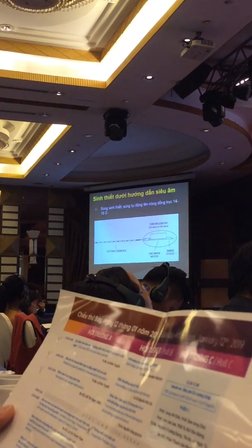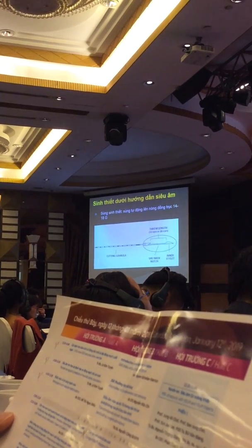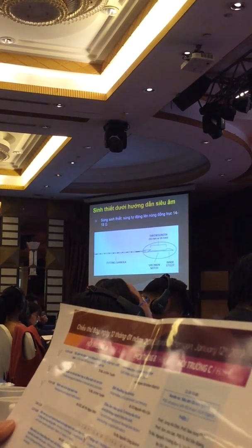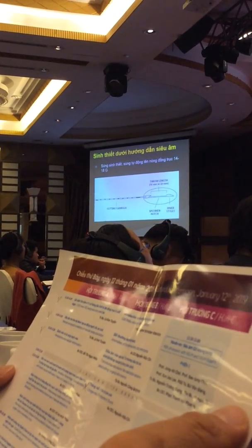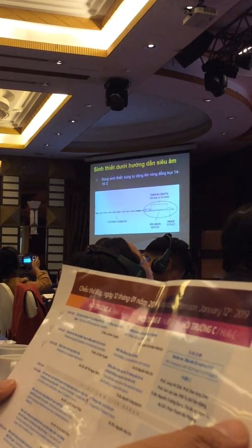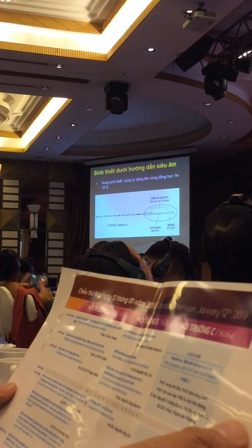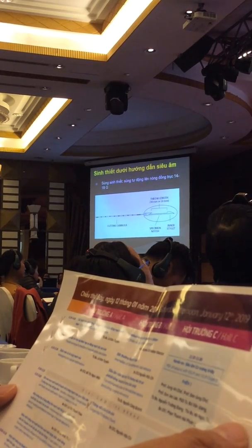A biopsy gun, there are many kinds of biopsy guns. I usually prefer the coaxial spring-loaded automatic guns. There are throw lengths of 1 or 2 centimeters. You choose 1 centimeter for smaller lesions, 2 centimeters for larger lesions.